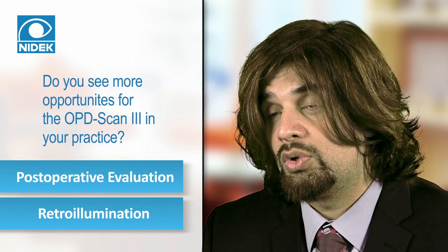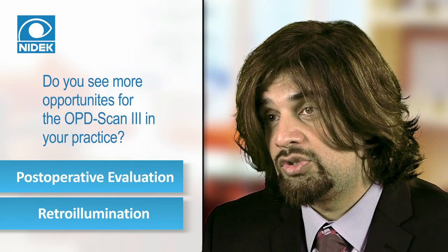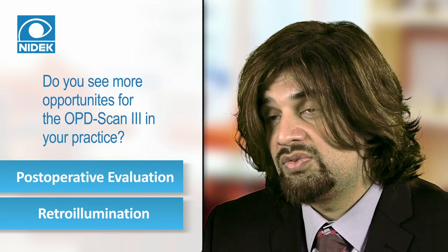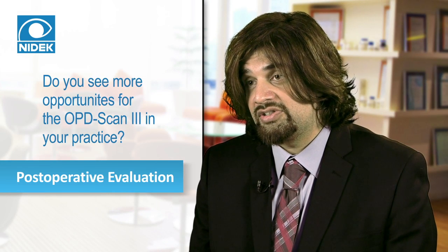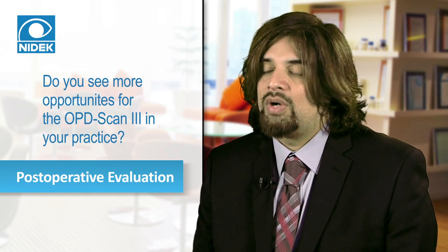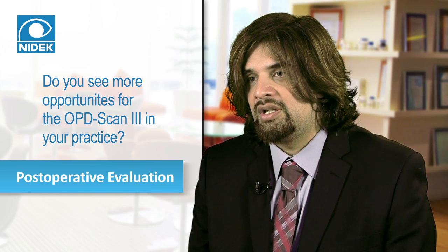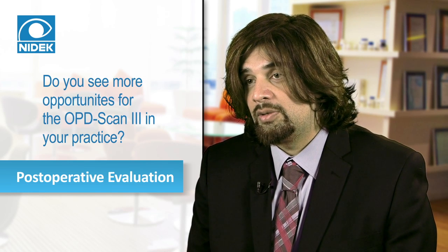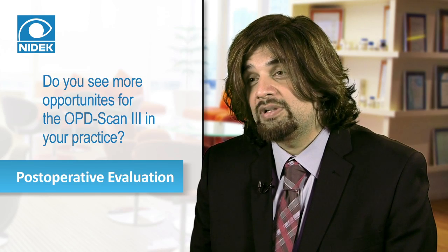And so being able to assess, for example, with retroillumination, the toric IOL tool, which is very nice to be able to see and evaluate where the toric IOL is planned and placed, is a great method to evaluate how accurate we are. It also helps us to evaluate the total higher order aberration in the system as well. It may evaluate why a patient may have visual quality issues. So the postoperative evaluation is another aspect of our practice, and it can be aided by this, for example, in patients who may not be completely satisfied, evaluating exactly what the problem is.